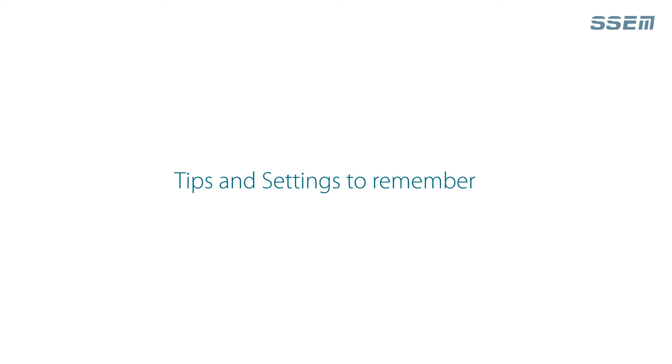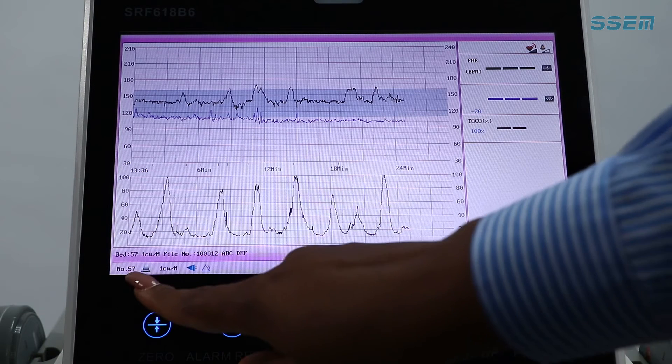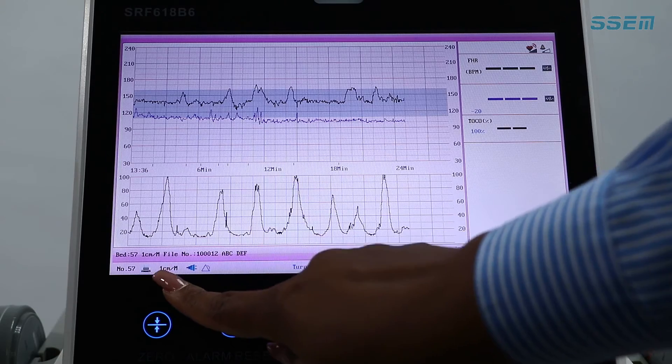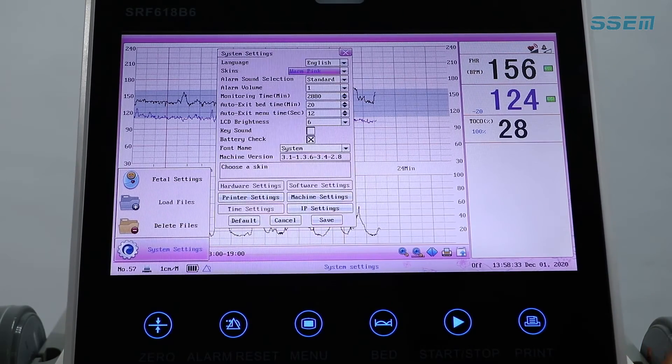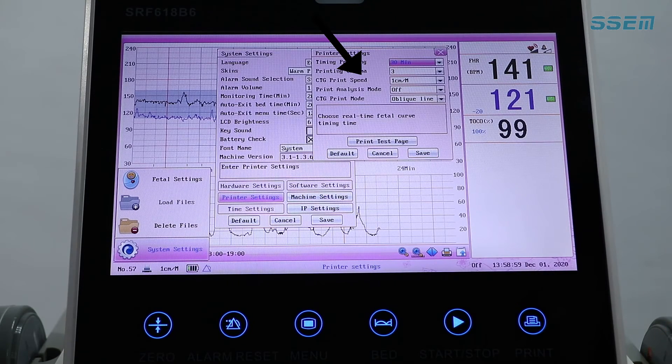Tips and settings to remember. Ensure that the CTG print speed is at one centimeter per minute. Follow this process. Press menu, system settings, printer settings, CTG print speed and set it to one centimeter per minute and save.